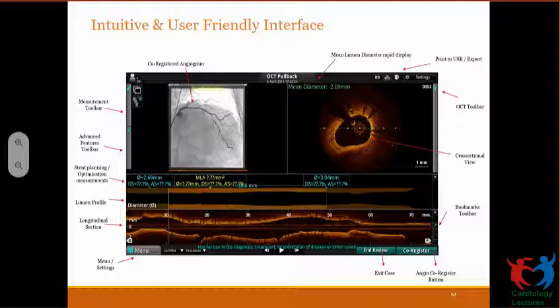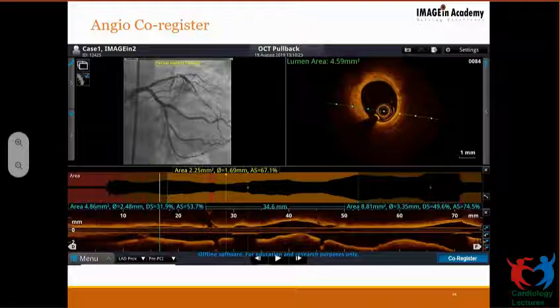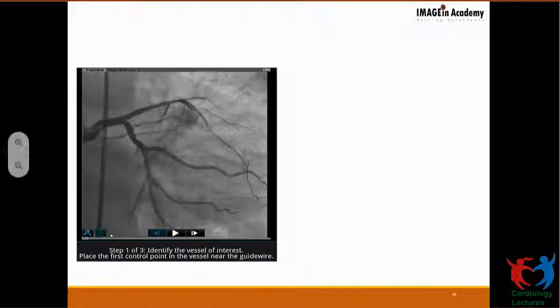Now, this is angio co-registration. So you see the angiogram of a given vessel on the left top. You see a cross-sectional image. So you need to go to the button which is now highlighted, the co-register. Once you have co-registered, you acquire the angiogram.